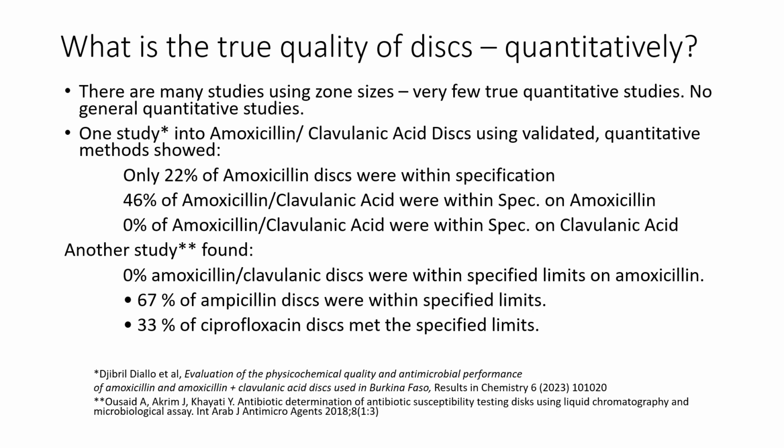There was 46% within spec on amoxicillin on this combination disc, and there were none that were in spec on clavulanic acid. Now, this study included a number of different manufacturers, including all the main manufacturers that you will be familiar with. So this is possibly quite a representative sample of the sort of quality you might expect.